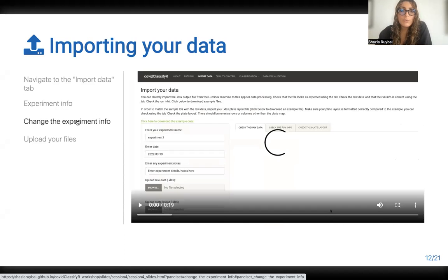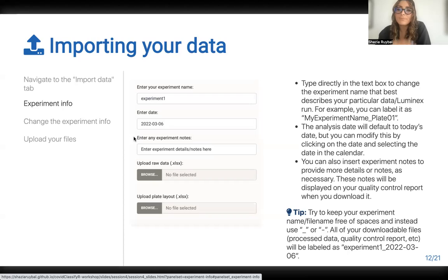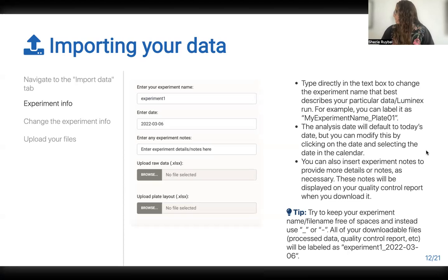So, Hey Shazia, I was just thinking, if we had a separate tab for maybe experiment date, and that. Oh yeah, that's a good idea. Analysis date should be the date of the analysis. Yeah, let me make a note of that. That's a good idea. Experiment date or plate run. Yeah, excellent. I'll definitely incorporate that. I think that's a good idea.